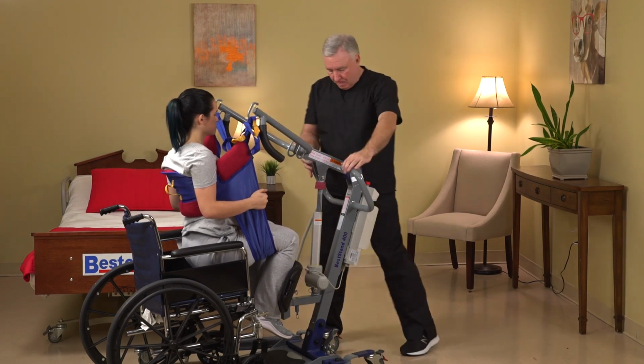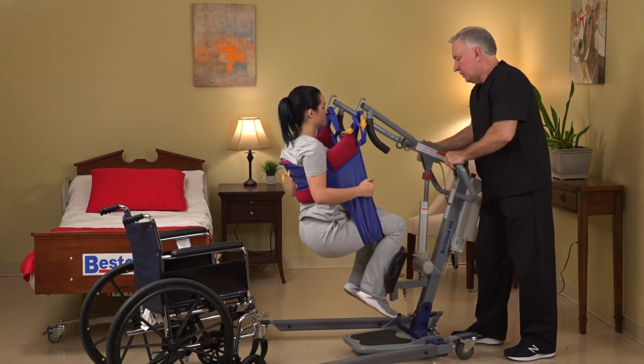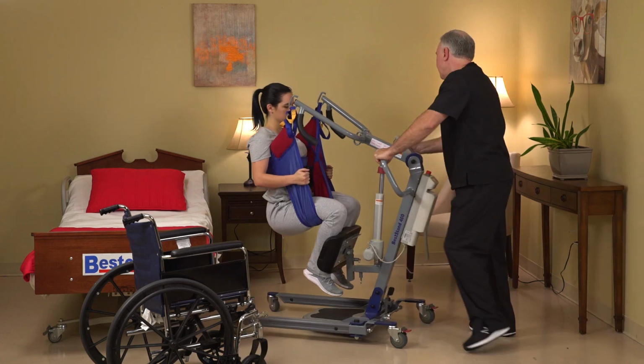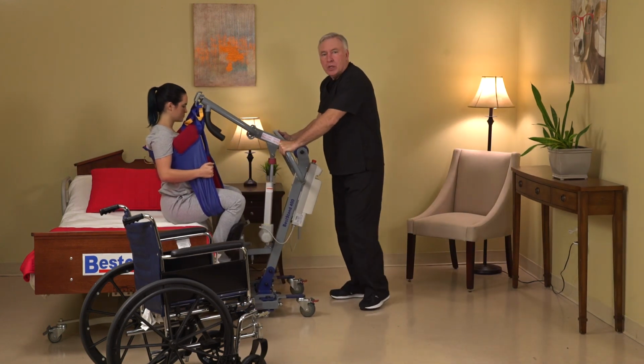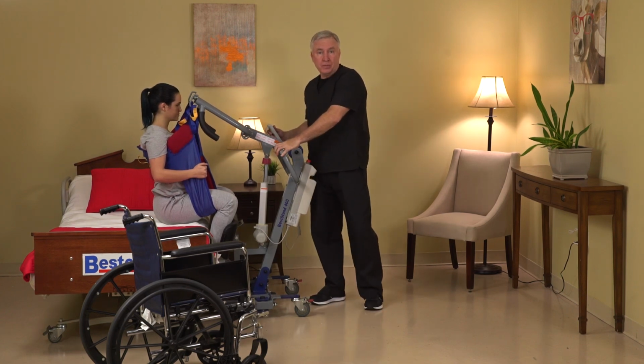Unlock the wheels. Close our base back down. And now you can see we can transfer the patient directly onto the bed from the wheelchair using the Sani sling.